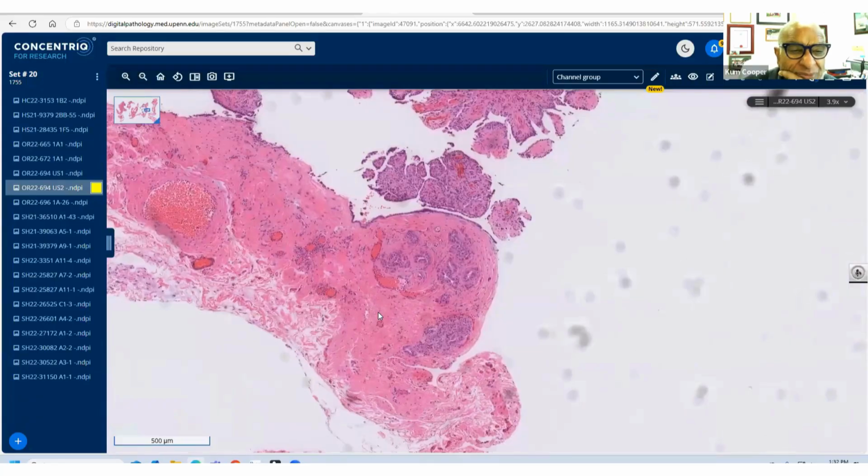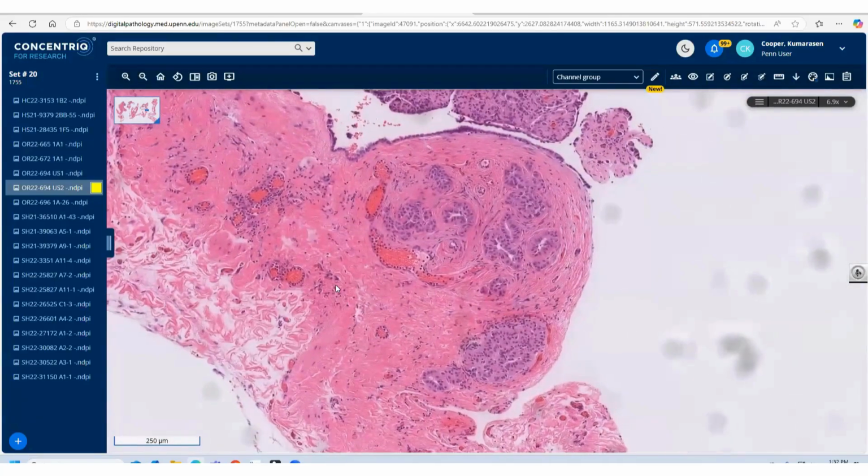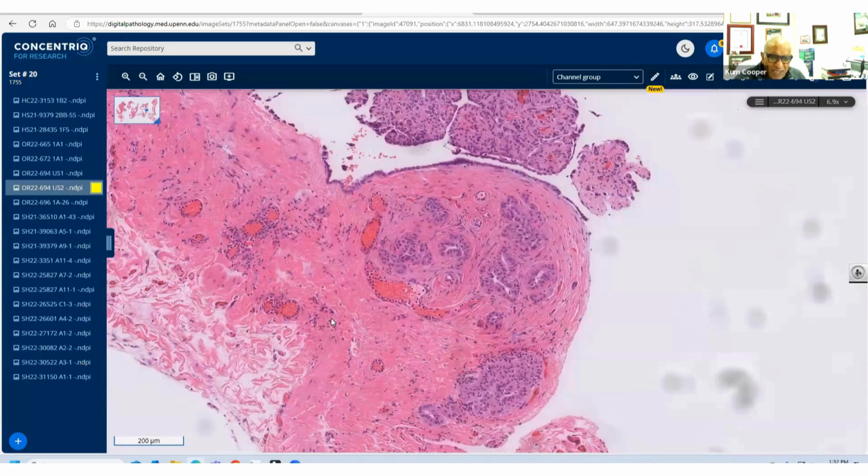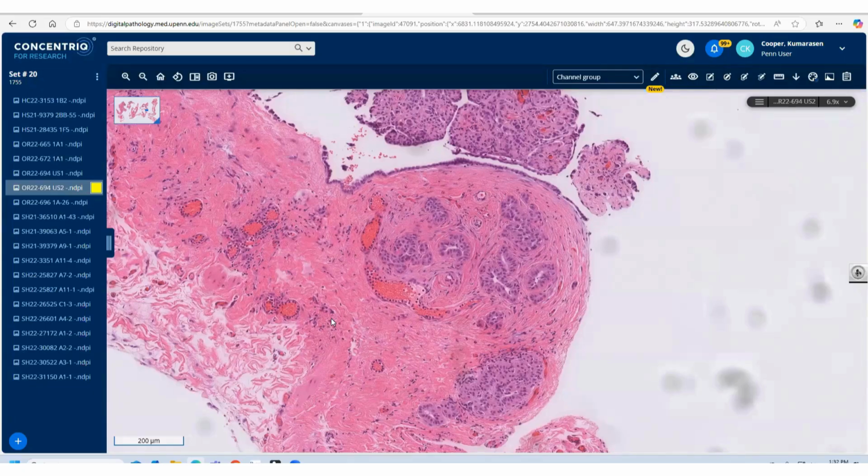Some people use P16. I think UCSF uses P16 as well, but I don't find that as helpful. Okay, that's very interesting. So MTAP is also lost in mesothelioma? In mesothelioma specifically, I use it more as a surrogate for CDKN2A or 2B loss in my gliomas or meningiomas. Oh, okay. I assume the same principle would work. That's why I didn't know any. I've only read about it, and it's a cytoplasmic marker, correct? Correct. Okay, that's very useful. Any other questions or comments anybody has?